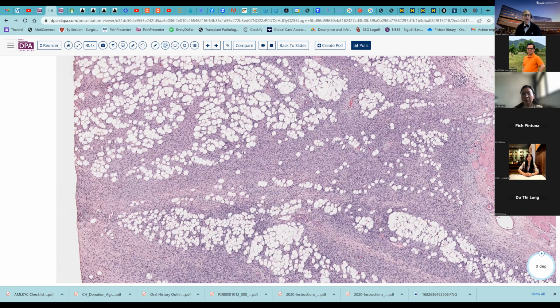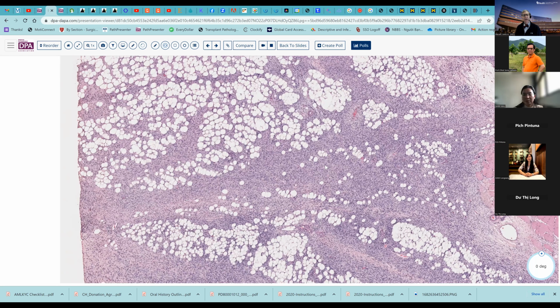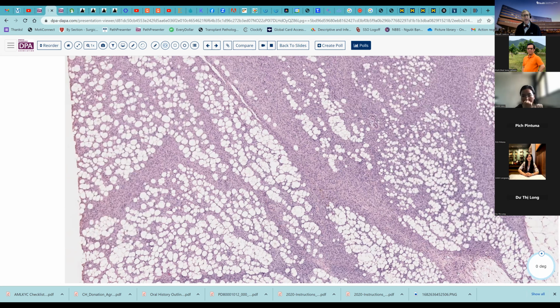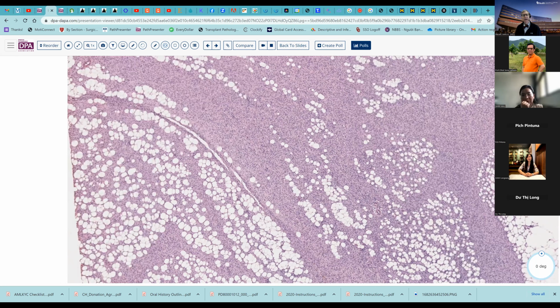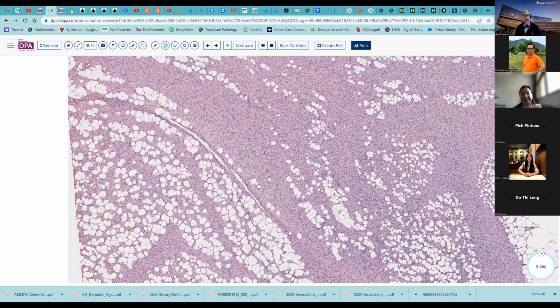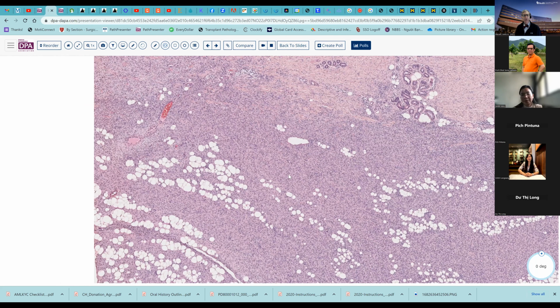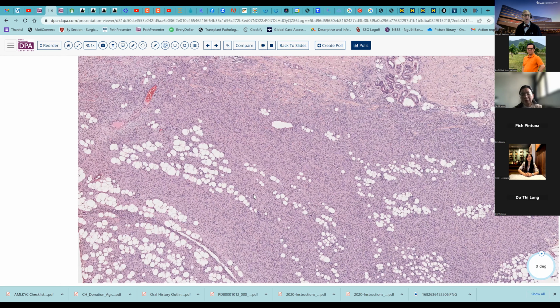I would say this pattern of engulfing the fat in this manner is really seen primarily in two lesions: dermatofibrosarcoma protuberans and the fibrous histiocytoma or dermatofibroma, which can occasionally extend into fat in this way. If this is very extensive, I would not call a lesion a dermatofibroma, even though they may have somewhat similar immunophenotypes. But this pattern of invasive growth into the fat should signal malignancy.